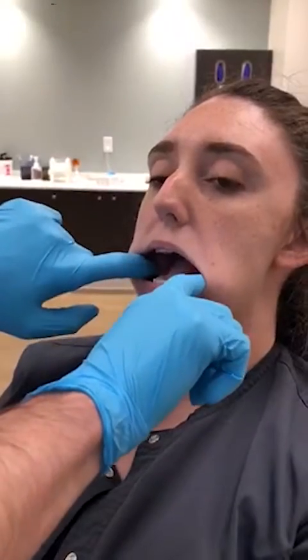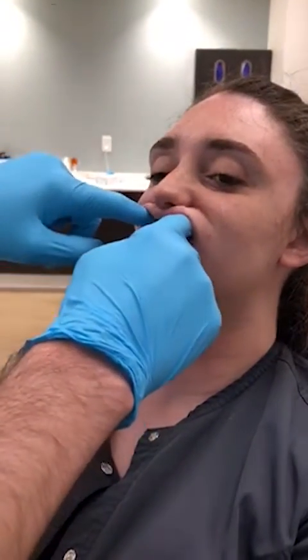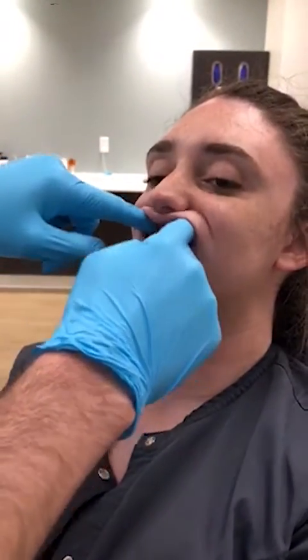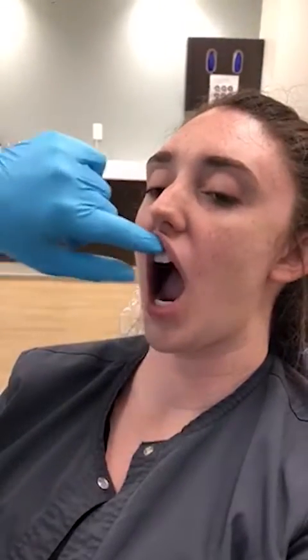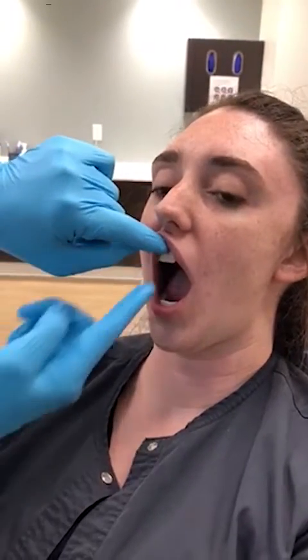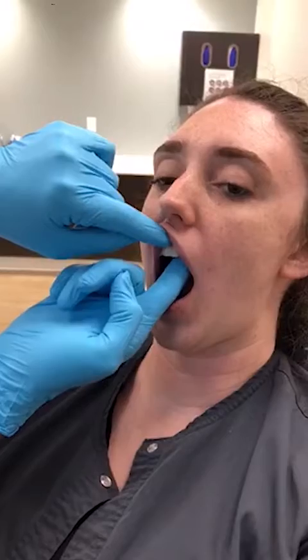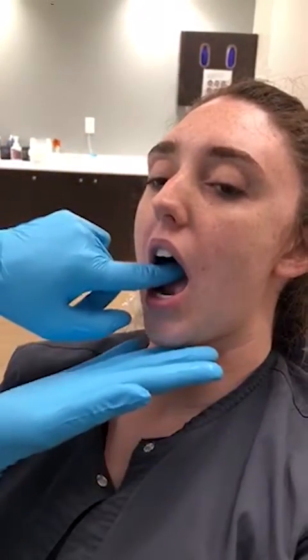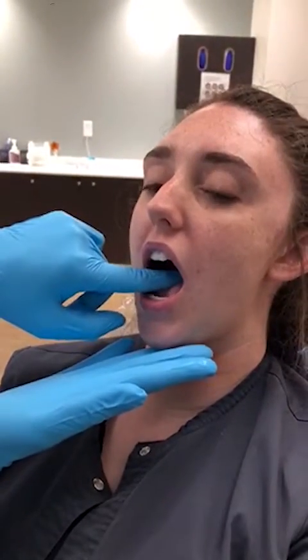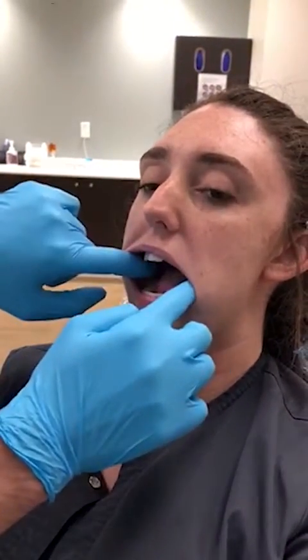I'll then have the patient bite down. This allows us to look at the maxillary vestibule and labial mucosa. The patient then opens and we can inspect as well as palpate the roof of the mouth. I then have the patient say 'ah,' which allows me to look at the throat and the anterior tonsillar pillars.